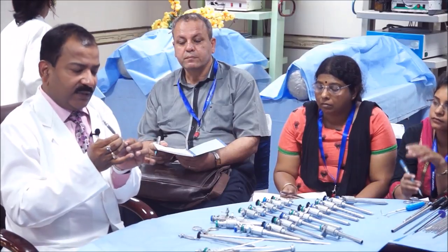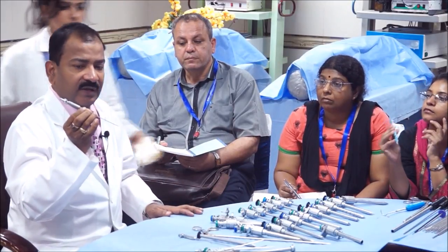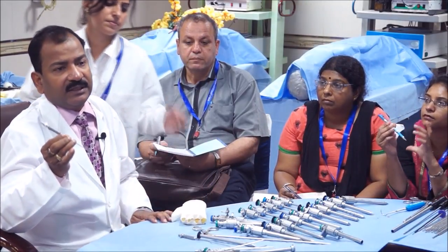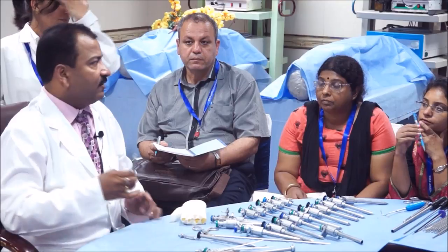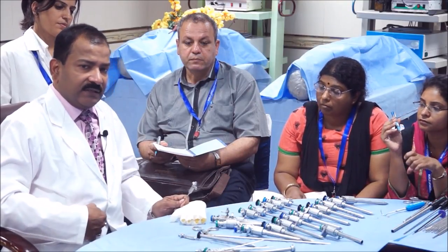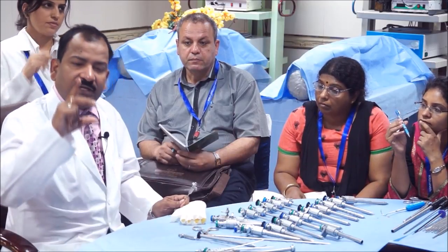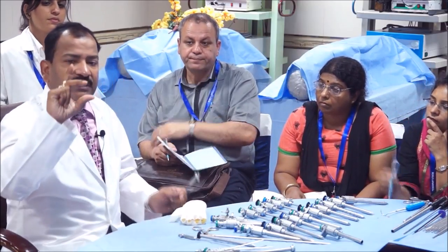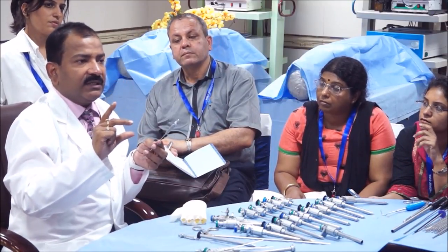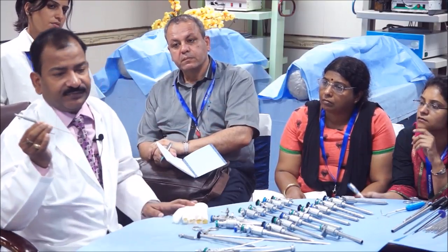And that much portion should be naked. And how much you will use it depends upon the thickness of abdominal wall. So, by the side of umbilicus, you should hold it like that. This is umbilicus and suppose this is the patient I am holding. So, it is that much thick. If it is that much thick, you have to add further 4 centimeters. So, this is and further 4, I have to hold it like this.